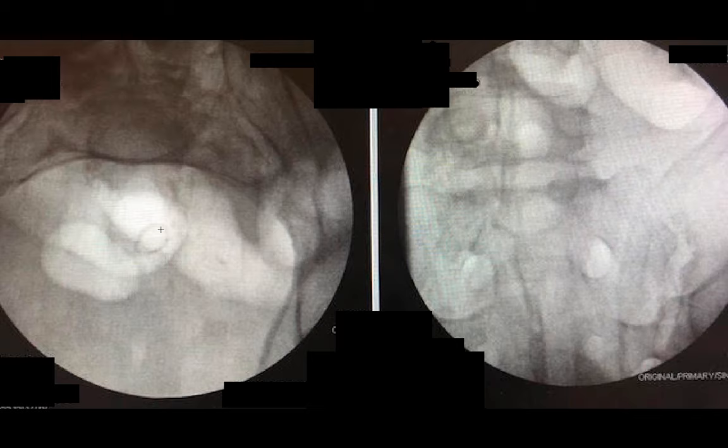My C-arm is a little bit larger and wider, but for these particular cases, I learned from my partner to use the smaller C-arm because it's a lot easier to get the various views that you need, because you're tilting down quite a whole lot, and before you know it, you're sitting on the patient's chest or belly, and a smaller C-arm helps to get those increased angles that you want. But because of that, the downside is I can't get a wide view, so I have to go back and forth to look at the various points of where I need to be.